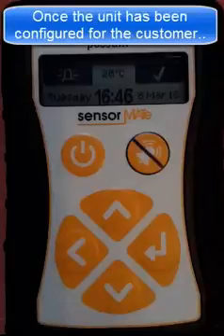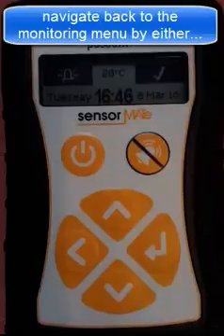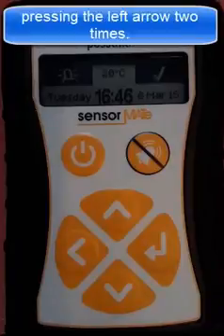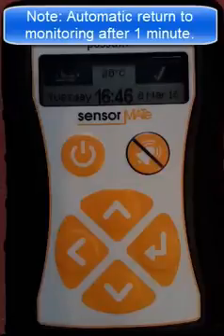Once the unit has been configured for the customer specific requirements, navigate back to the monitoring menu by either pressing the standby button momentarily or selecting the left arrow two times. Note that the unit will also return to automatic monitoring one minute after the last button press.